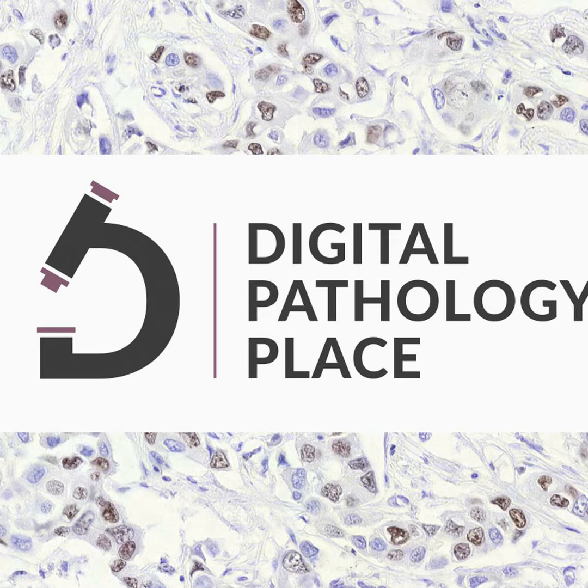So look, we can infer that they looked at the whole background. They saw these big cells that were bordering on multinucleated. And they said, Hodgkin's, it must be Hodgkin's, must be Reed-Sternberg. Check, next case. So that was one reason, and I think that's plausible based on our data.